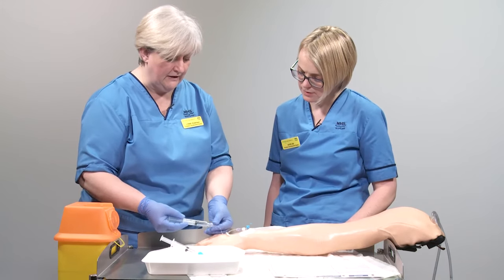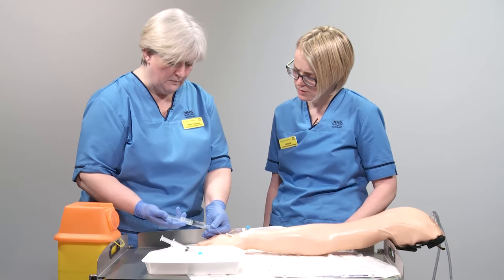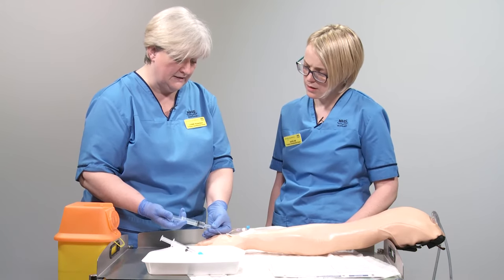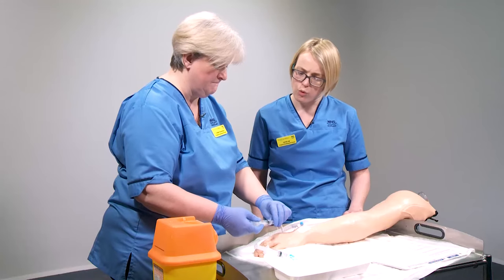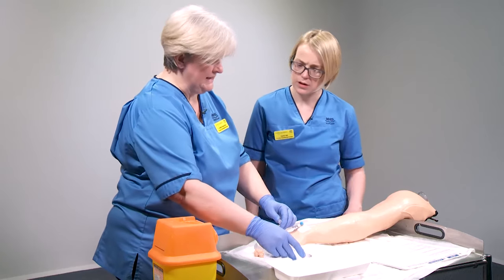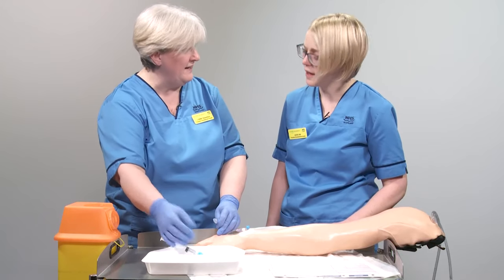The flush needs to be given using a push-pause technique — push, push, push on the plunger — and you can see it's going in really easily. That clears any medication from the line and confirms the needle is clearly in the vein. If you feel any resistance when administering the flush, that may indicate the cannula isn't in the vein properly and you would need to get further advice. Keep some of the flush back because you'll need the rest at the end of the medication.